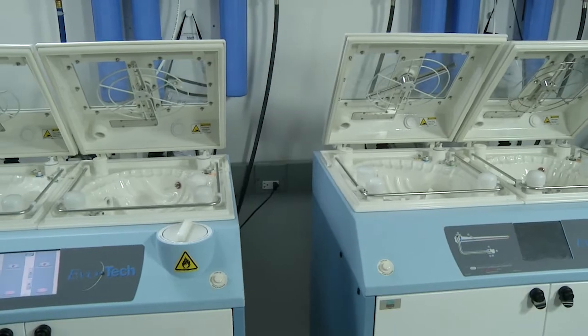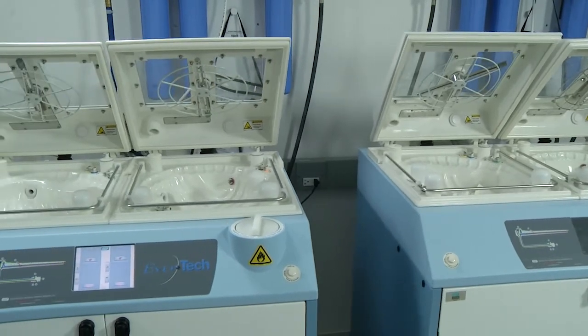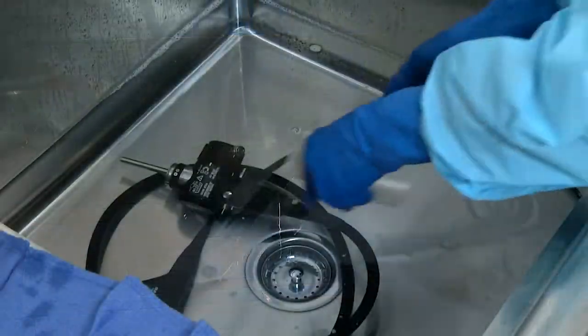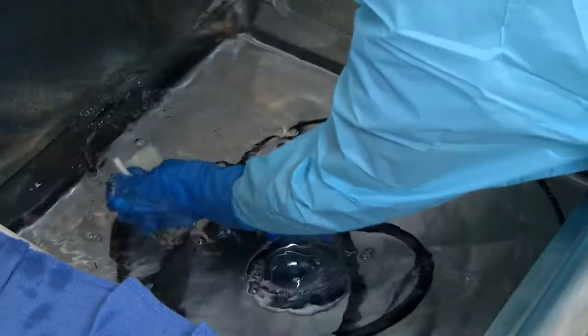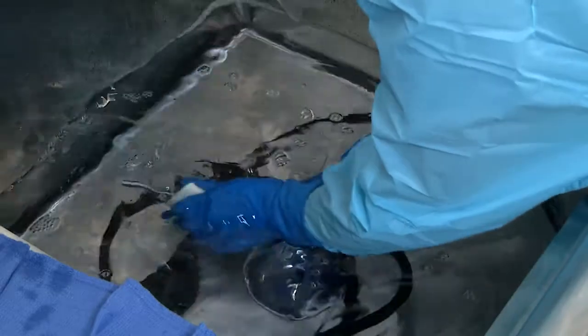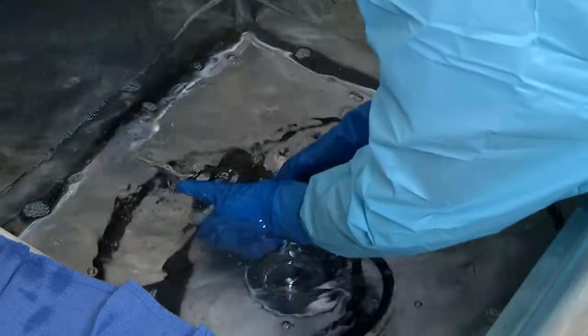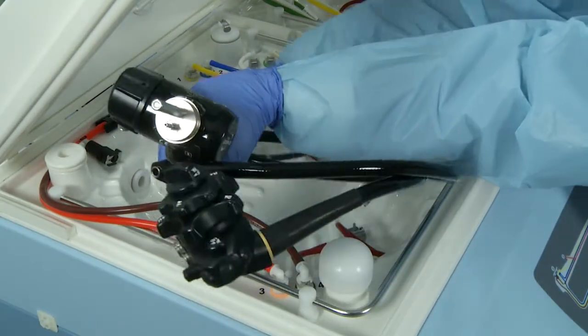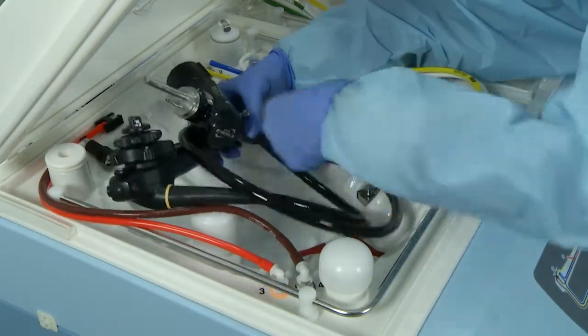The EVOTECH ECR has been validated by the FDA to eliminate the manual cleaning process of the endoscope. However, it is the facility and department's decision to determine the extent of manual cleaning required prior to placing the scope in the EVOTECH. Use of the EVOTECH ECR does not eliminate bedside cleaning and may not eliminate manual cleaning.